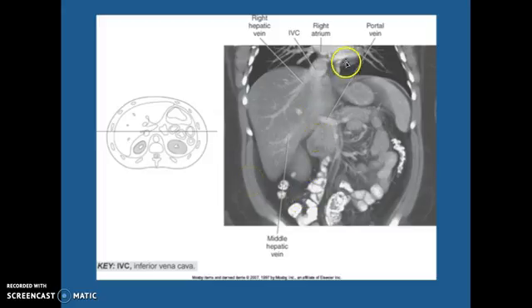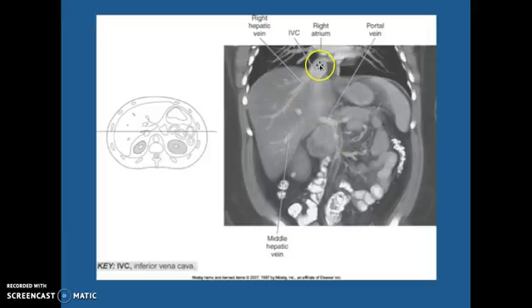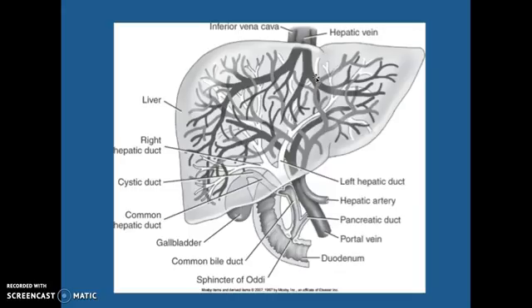If we're looking here, you can see your portal vein right there with your right hepatic vein going into your inferior vena cava. So your hepatic vein and your inferior vena cava — this is the system within your liver.